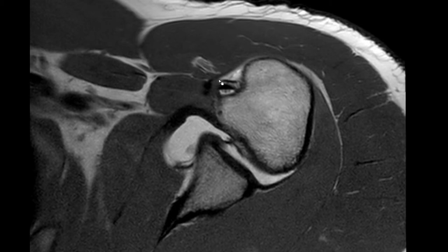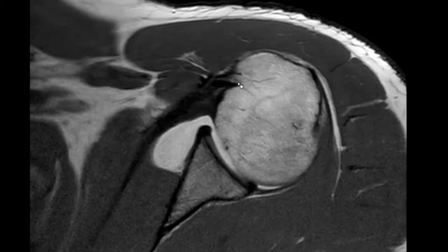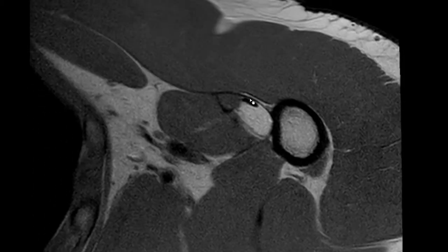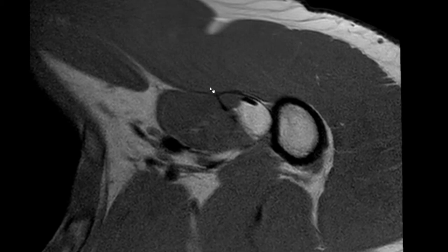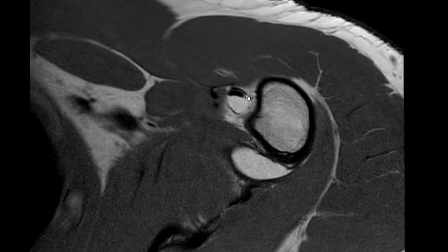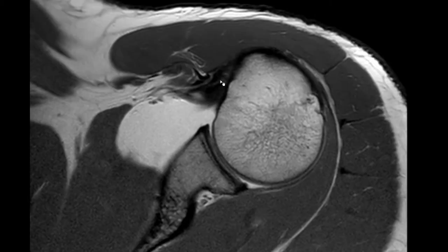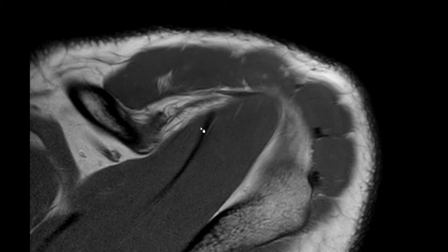In this last case, you have this finding in the bicipital groove and it could be mistaken as a split of the long head of the biceps tendon. But if you follow it through, you can see that one is blending in with the pectoralis major tendon. And if you follow it proximally, you can see how it's blending in with the supraspinatus tendon.